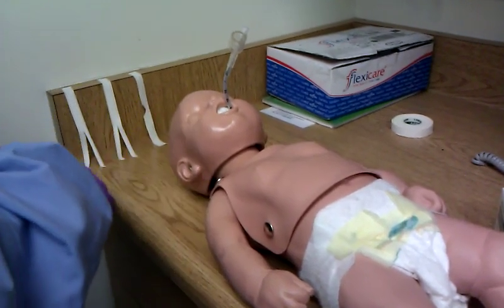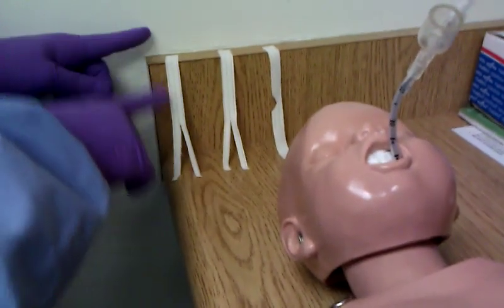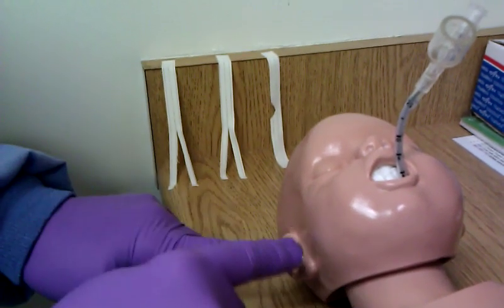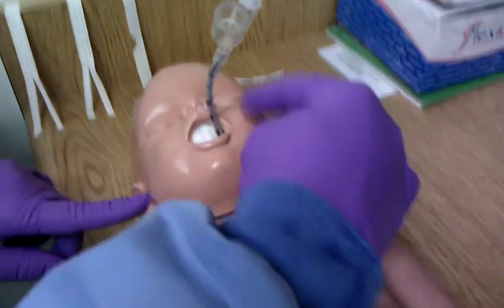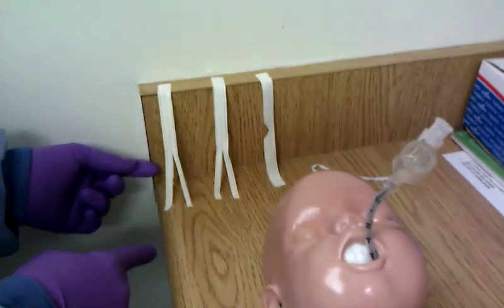When you're taping the endotracheal tube, you want three pieces of tape. These two pieces of tape are approximately the length of the ear to the opposite side of the opposite cheek, and then split down the middle like this.